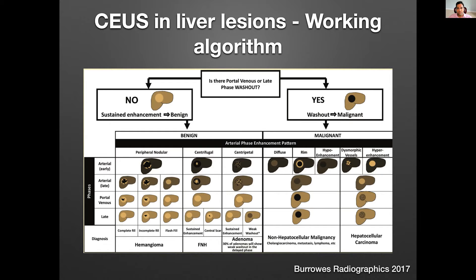On the malignant branch — if you have washout in the portal venous or late phase — you differentiate HCC versus non-hepatocellular malignancy. The LRM pattern on CT and MRI — cholangiocarcinoma, metastasis, lymphoma — shows either diffuse, rim, or hypo enhancement, then very fast washout within the first minute, a 'punched out' appearance. Versus HCC, which may show hyper enhancement or dysmorphic vessels, then very weak and slow washout — maybe slight washout at portal venous phase and more washout at the late phase.